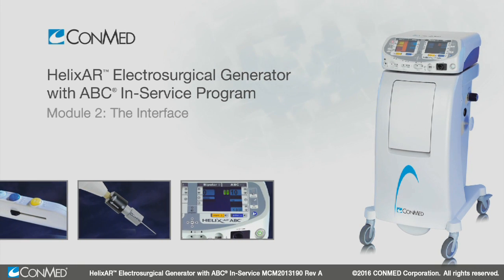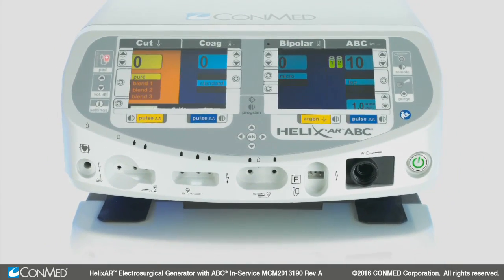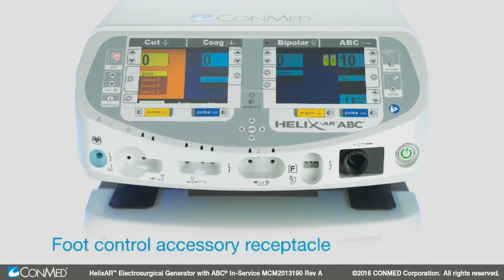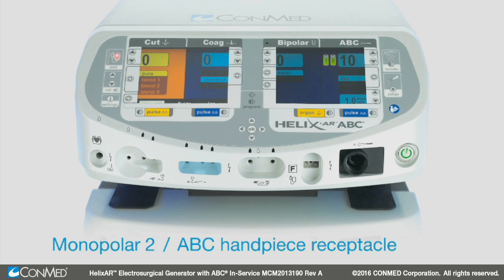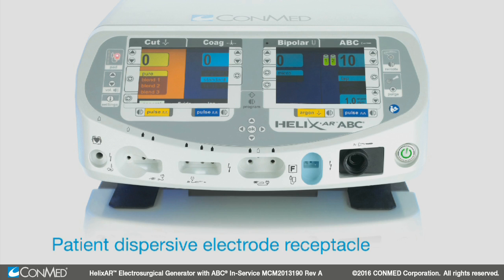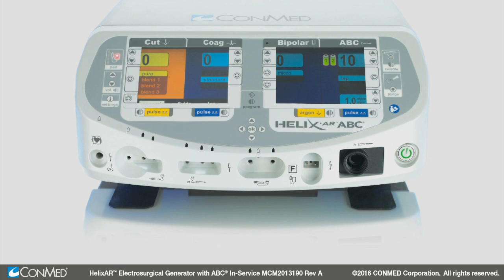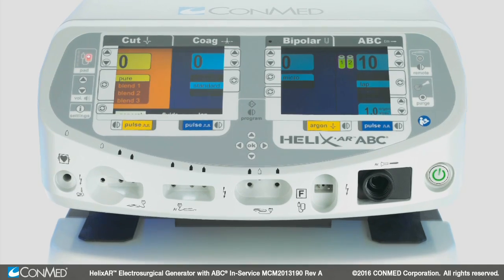The ConMed Helix AR interface is robust yet easy to use. Looking on the front of the unit from left to right, you'll notice the foot control accessory receptacle, the monopolar 1 foot control receptacle, which accepts both hand control and foot control accessory connectors, the monopolar 2 ABC handpiece receptacle, the bipolar accessory receptacle, the patient dispersive electrode receptacle, and the ABC handpiece receptacle. Note the icons for these accessories are below or adjacent to the specified receptacle.